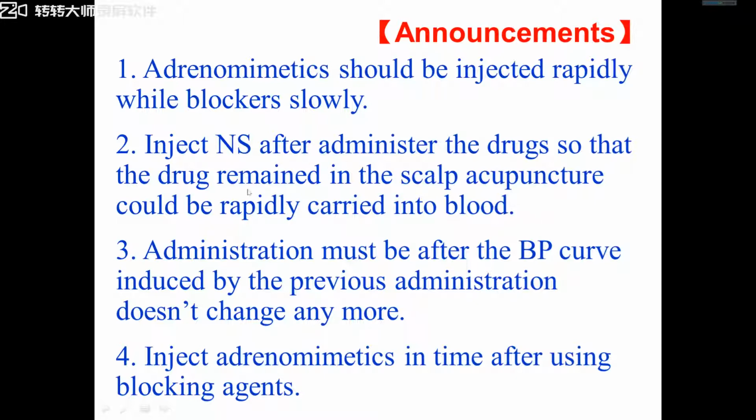Follow this principle. The third: administration must be after the blood pressure curve induced by the previous administration doesn't change anymore. Yes, we inject drugs after the blood pressure is normal, and we give the drugs one by one.